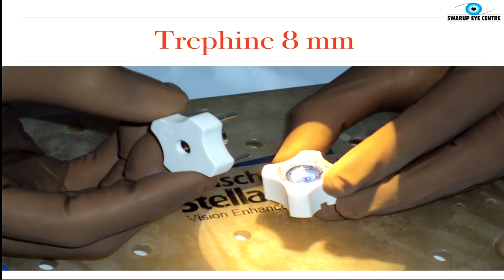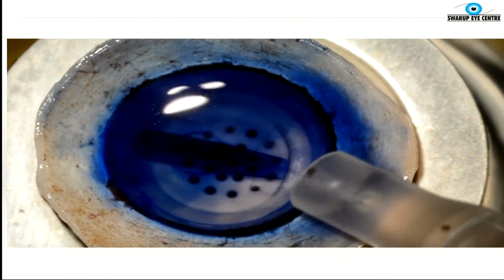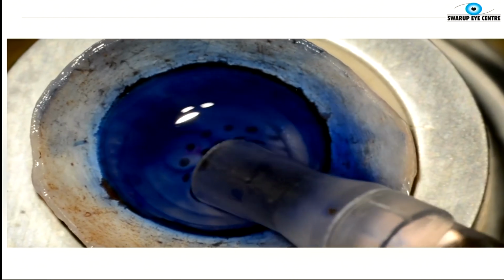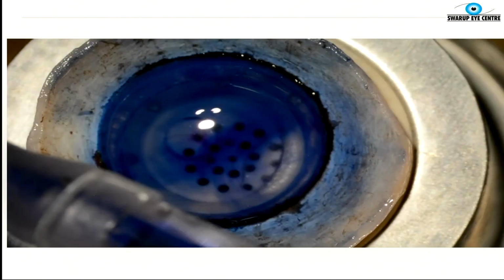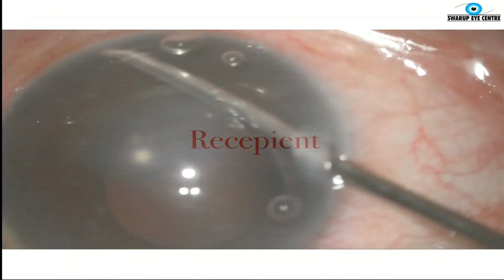After that, you trephine to 8 mm. Ideally, again, this should not be a full thickness trephination, but a partial thickness, just to cut the Descemet membrane. And then whatever is left can be stripped off. Once that is done, you stain the scroll for about a minute or 2 with trypan blue, and under fluid you can aspirate it using one of the various injectors. Most of these DMEK injectors or cannulas have a broad end and a narrow end. So while drawing the tissue, you keep the narrow end towards the syringe and draw from the broad end. And once it's inside that injector, you can invert it and then inject with the narrow end facing into the anterior chamber.